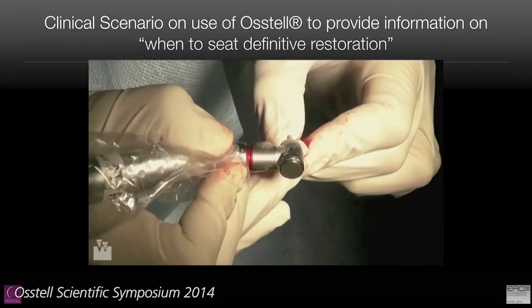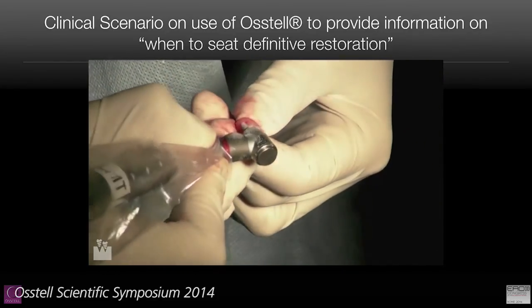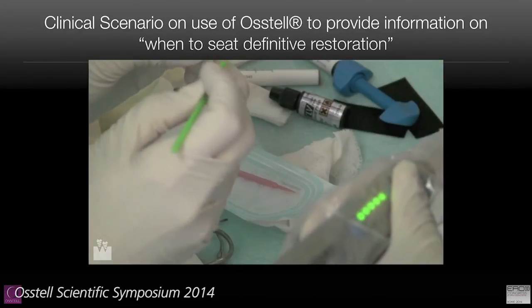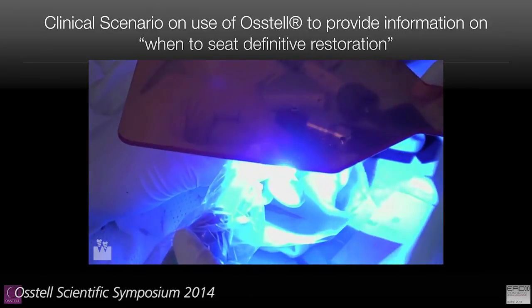And so the key is not to allow the restorative events that are taking place right now to loosen that abutment. That is the reason why I torque that abutment screw down first and leave it at that.